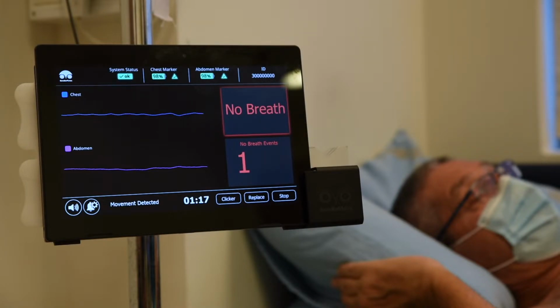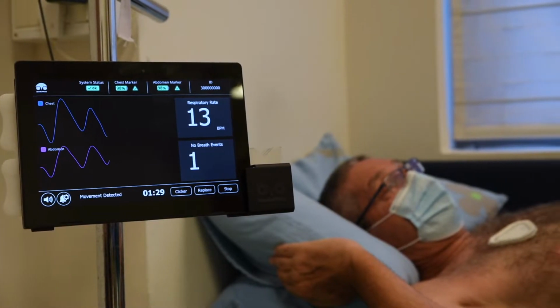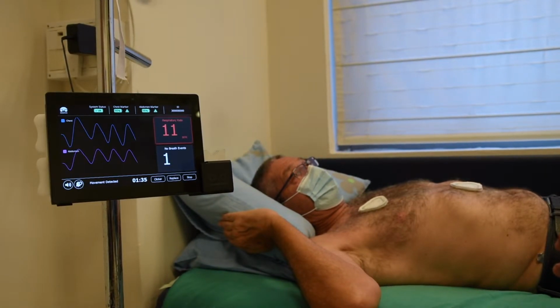Now ask our patient to continue breathing, normal tidal volume, inspiration and expiration. And we see once again just how the monitor is sensitive to show the fact that the breathing pattern resumes normal format, and the patient is now breathing 13 breaths per minute.